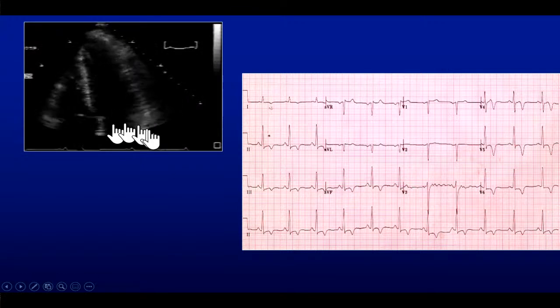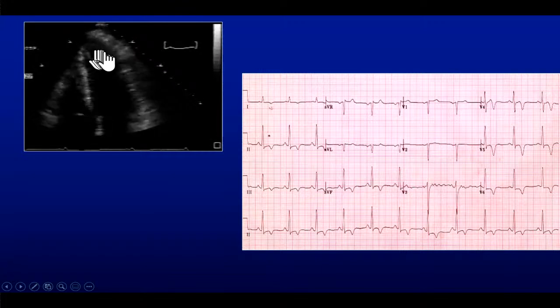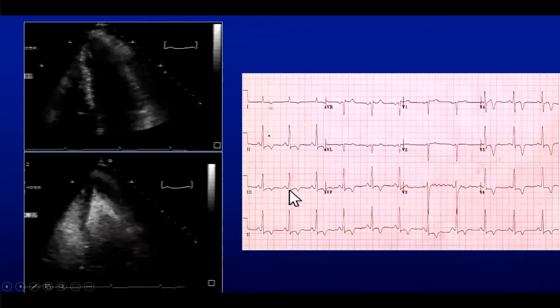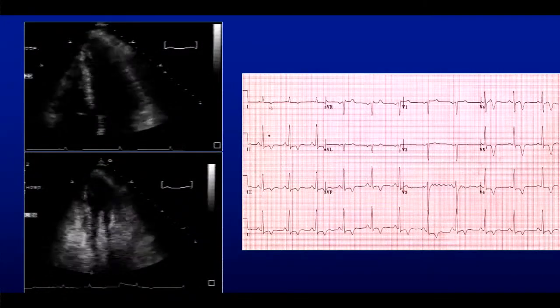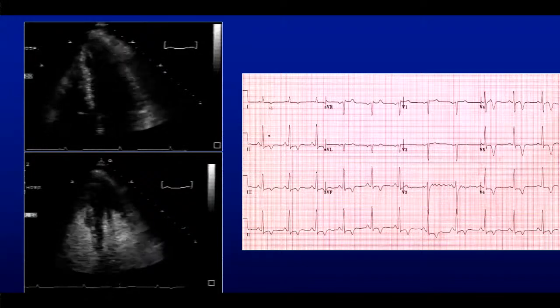And you could take a look. This is the resting echocardiogram. There's a suspicion of an abnormality in the apex. I cannot tell, right? Perfect place to use contrast. There you go. There's an apical hypertrophy, right? So, I mean, that's your differential diagnosis when you see such an EKG.